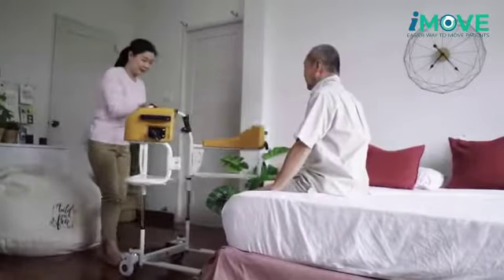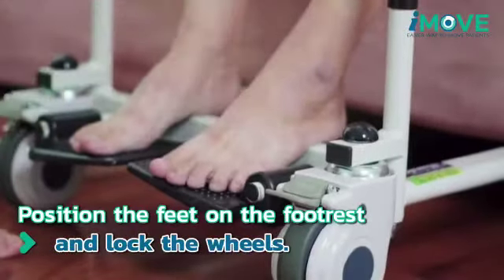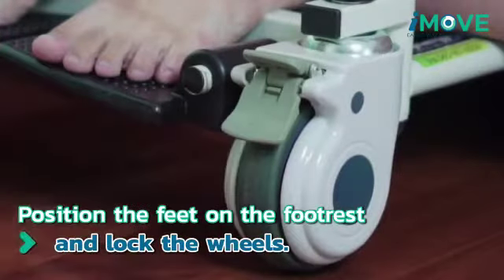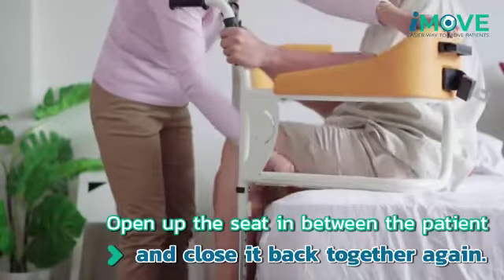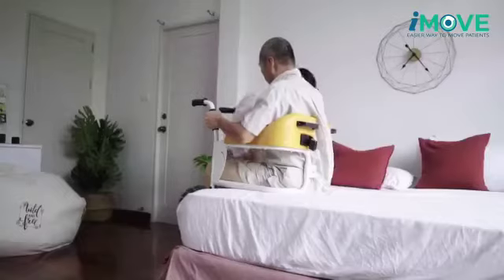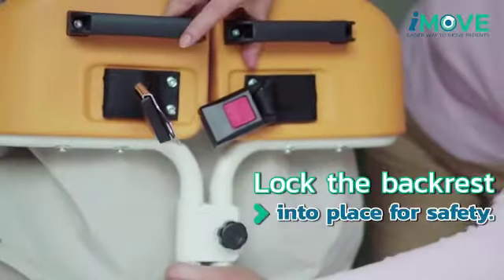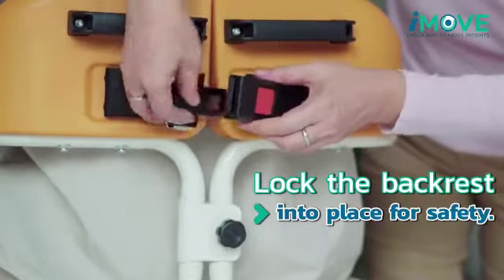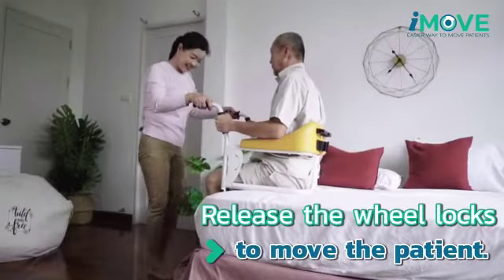It can be used to lift and move patients easily and helps to prevent potential injuries for both the patients and caregivers. While lifting and moving the patient, the iMove Chair has a backrest and a newly designed seat that can be opened and closed, a double lock and grip handles, allowing the patients to be stable while using the chair.